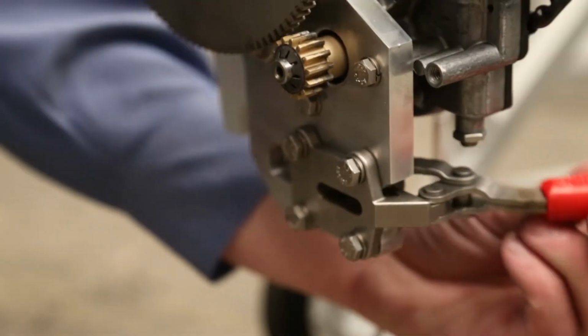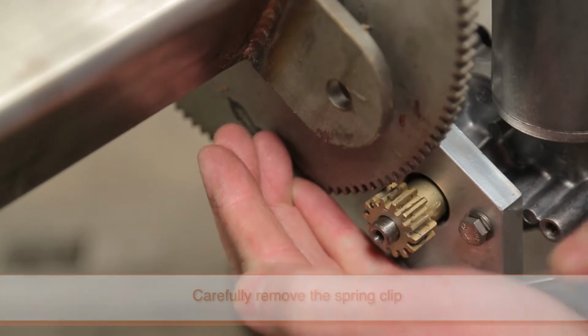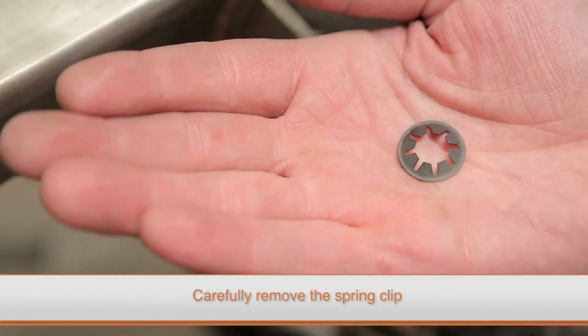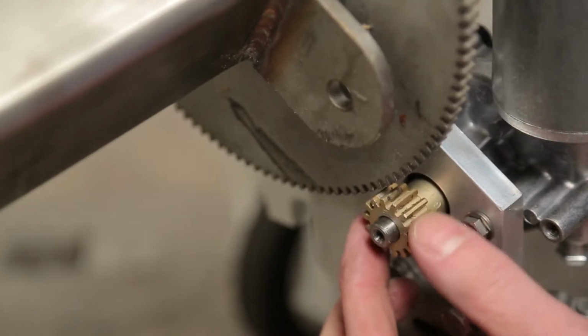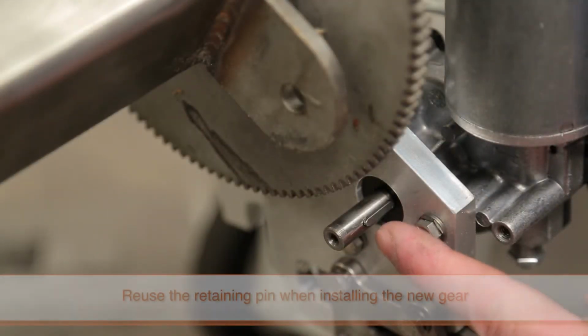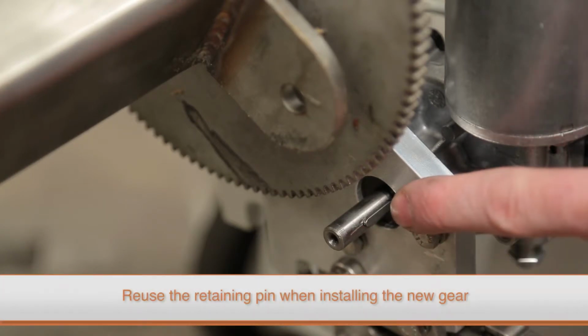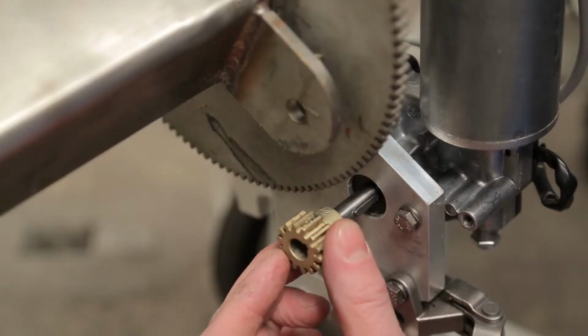To replace the small gear, first disengage the toggle clamp. Then remove the spring clip on the top of the gear using a small flat blade screwdriver to work the clip off the motor shaft. With the clip removed, pull up on the gear to remove it. Make sure to keep the retaining pin that locks the gear on the motor shaft, as it will need to be reused when replacing the gears.